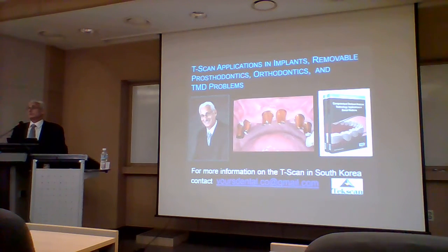In this era, with digital scanning, it's more possible because you can scan the teeth that are shaped pretty well, and then you can reproduce them anatomically. And then you have a similar force pattern. But if you make all new occlusal surfaces and you make all new artistic forms, then the T-scan will help you create a functional end result that's very high precision. But duplicating it is only possible if you can really duplicate the tooth surface.